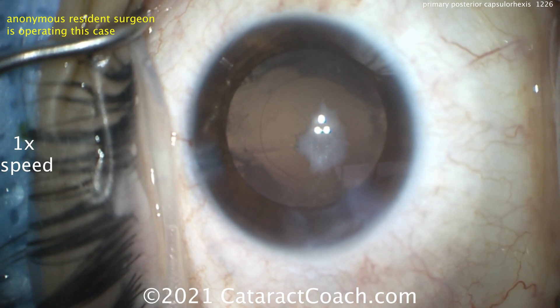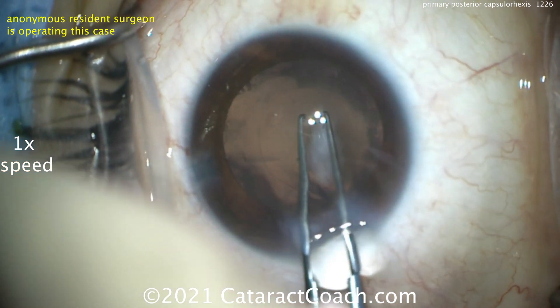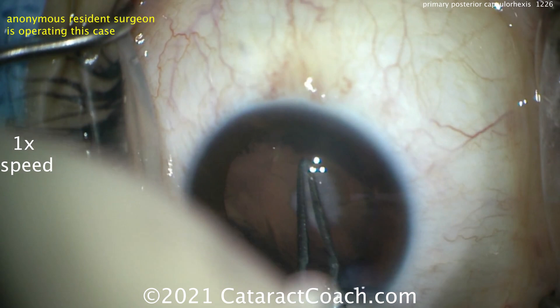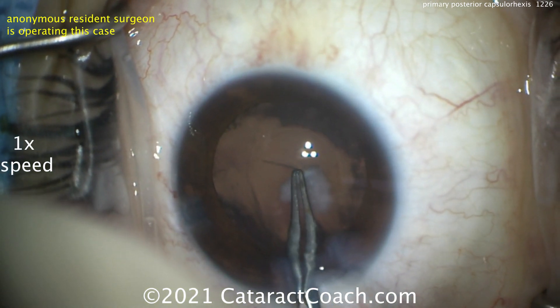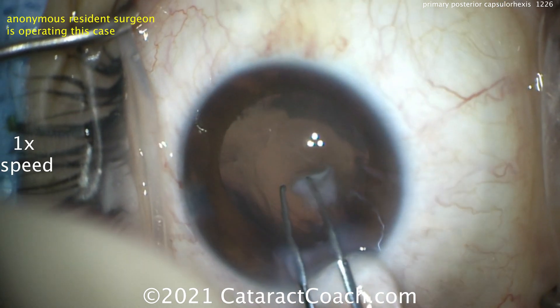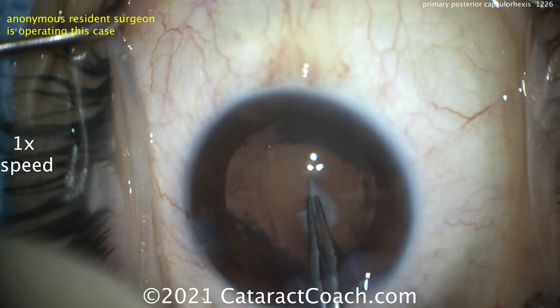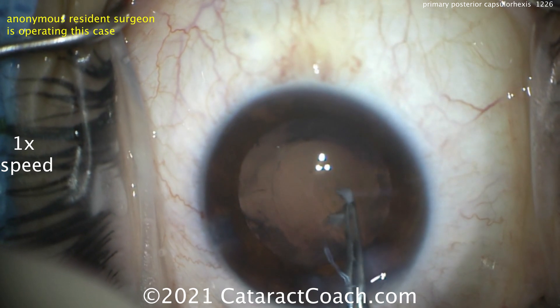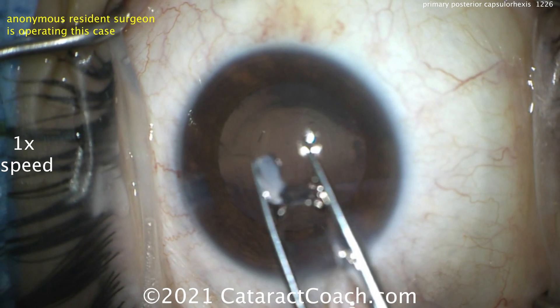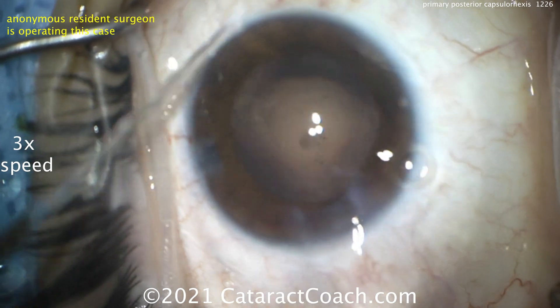That looks pretty good. We can inject a little more viscoelastic if needed, or just grab the forceps and start tearing this rexis. Get it going — there we go. You can stop and put viscoelastic here. Some of the natural viscoelastic already in the eye is going to push back against the hyaloid face. As we open this up, we're getting our own viscoelastic pushing back — in this case, we really didn't need to add more. There's our posterior capsule tissue, including that plaque, which has been removed nicely.